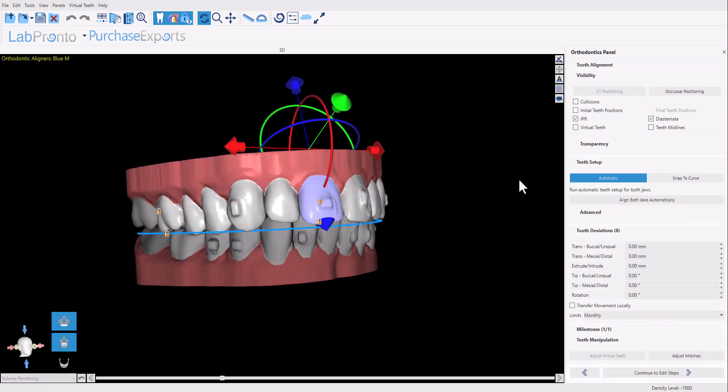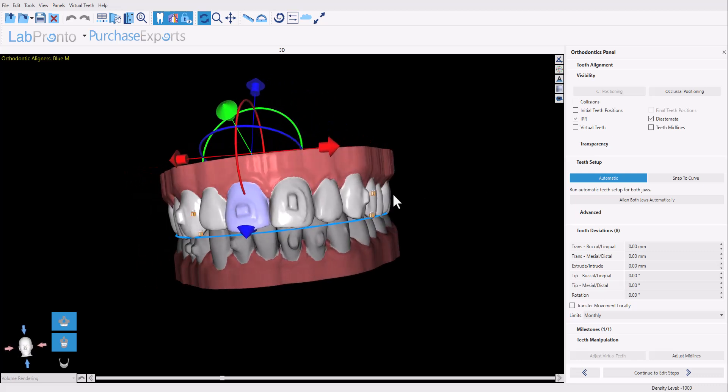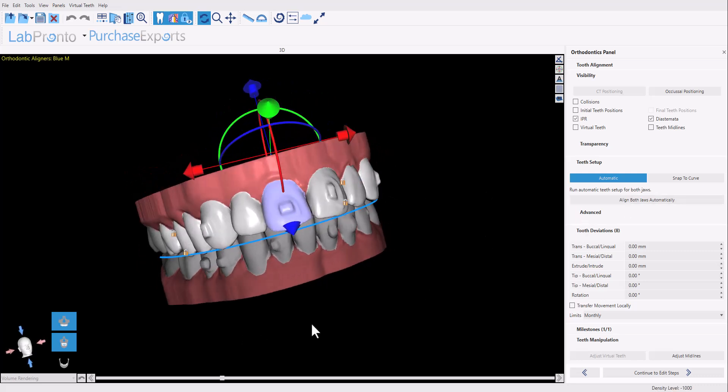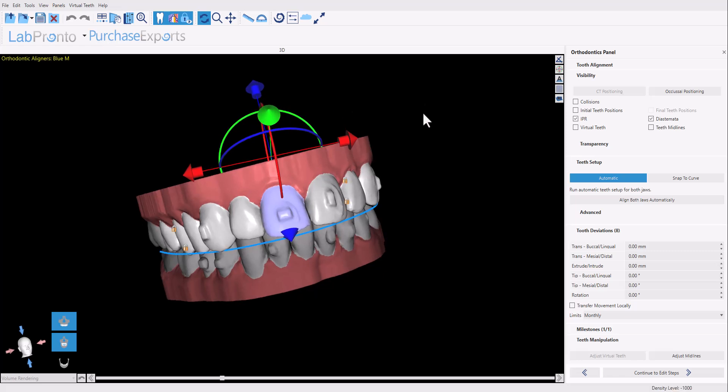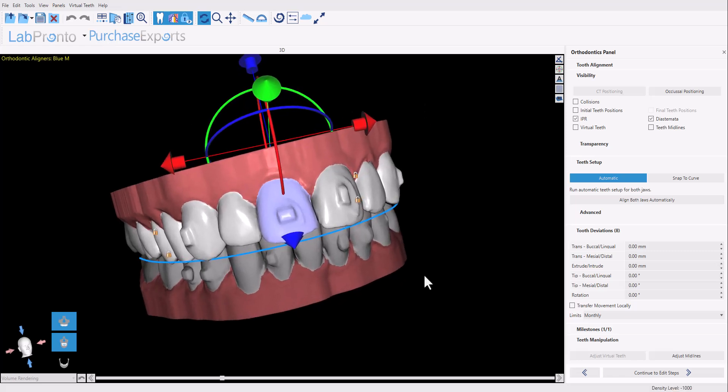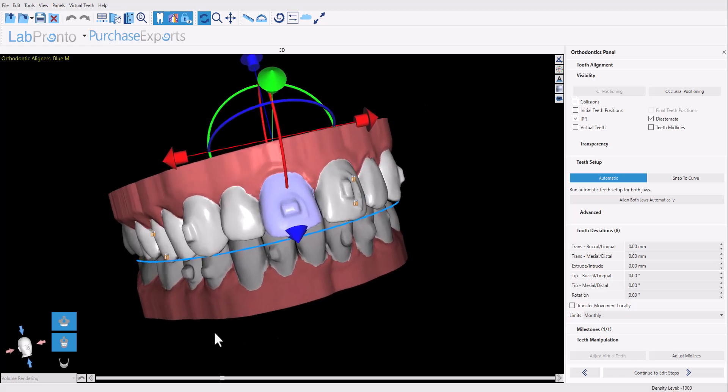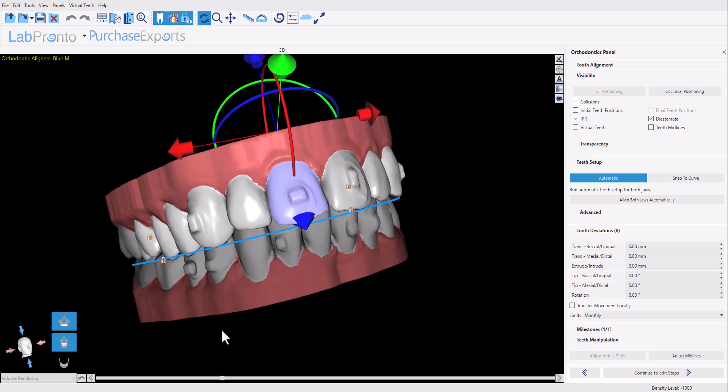So now we're at the point in the process where the user would do the tooth setup. We have new automated functionality to prepare the setup automatically for the user to review and modify as needed. But since this is a mid-course refining case, we already have the setup done. So this is a new scan, we've imported a new scan, but the final teeth positioning that we're trying to achieve was already done in the original digital plan.